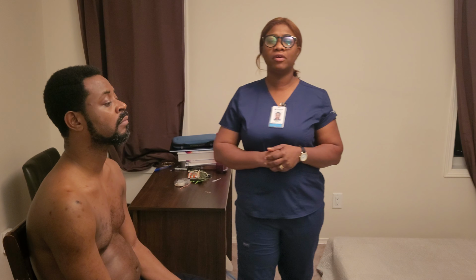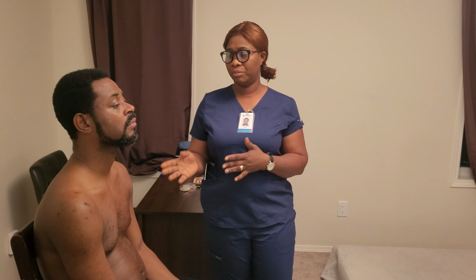Hi, I'm here to perform inspection and auscultation of my patient's anterior chest and posterior chest. I already performed my hand hygiene. I already checked all those. I'm just supposed to do the inspection and the auscultation of the posterior chest and anterior chest.